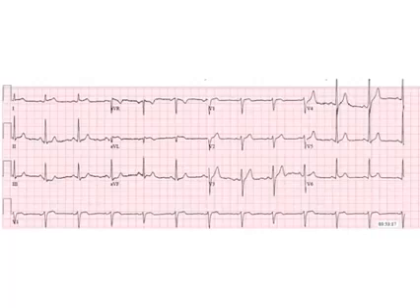You're going to look at the ECG. You're going to find if it's sinus or not, and you're going to find out if there's any other abnormal findings like ST segment elevation, ST segment depression, Q waves for different types of ischemia, etc. So I don't want you to come into this lecture being like, rate, rhythm, axis, don't do that. That's not going to help you on USMLE, and it's not going to help you on COMLEX.